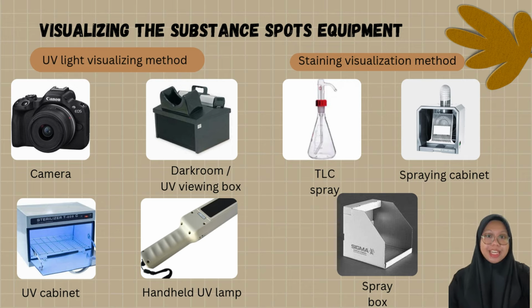Second, the staining visualization method. This method helps when the spots are not visible under UV. It involves a TLC spray bottle to apply chemical reagent, a spraying cabinet for safety during the spraying, and a spray box to contain fumes and prevent contamination.